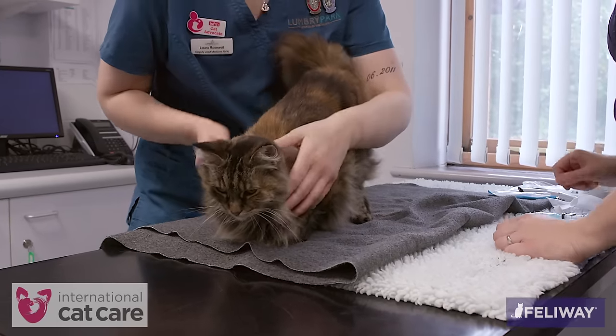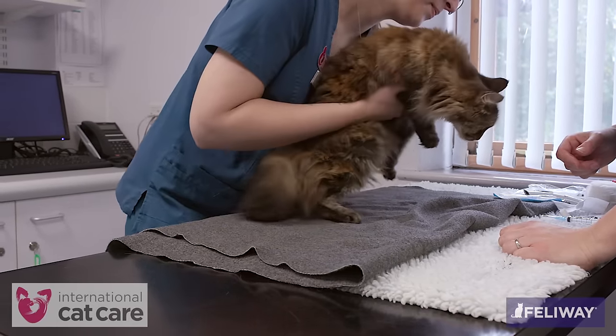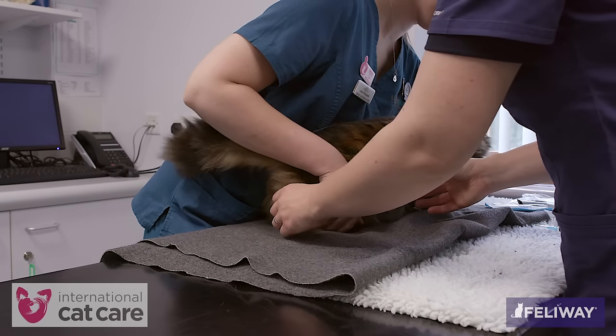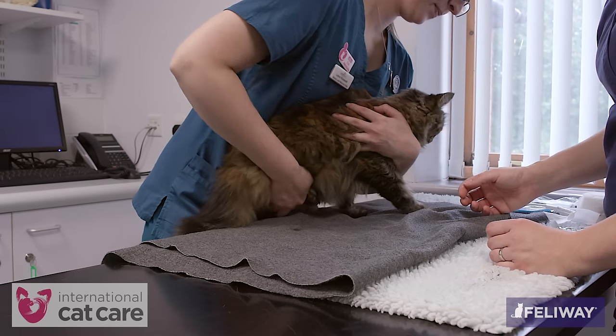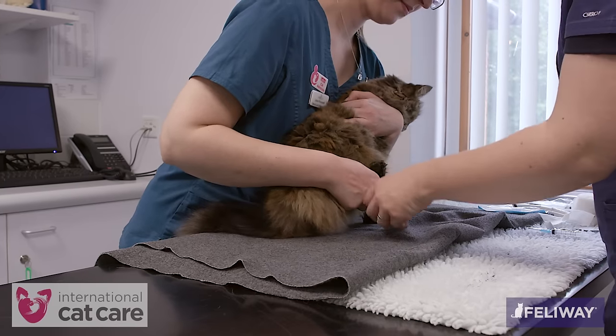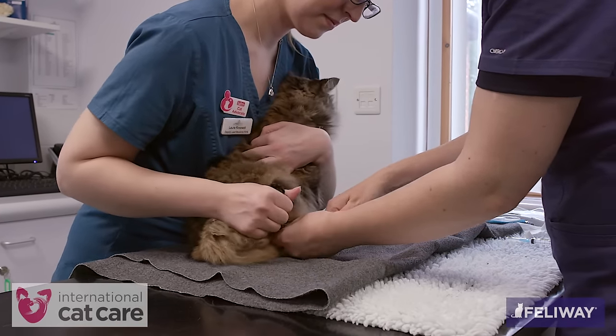The medial saphenous vein can be used as an alternative site for intravenous catheterization. The cat is allowed to remain standing or lying down at the front end, with the hind limbs extended towards you. The assistant can hold the top leg and raise the vein if the cat is amenable. Excessive restraint is avoided and the cat is stroked and reassured.